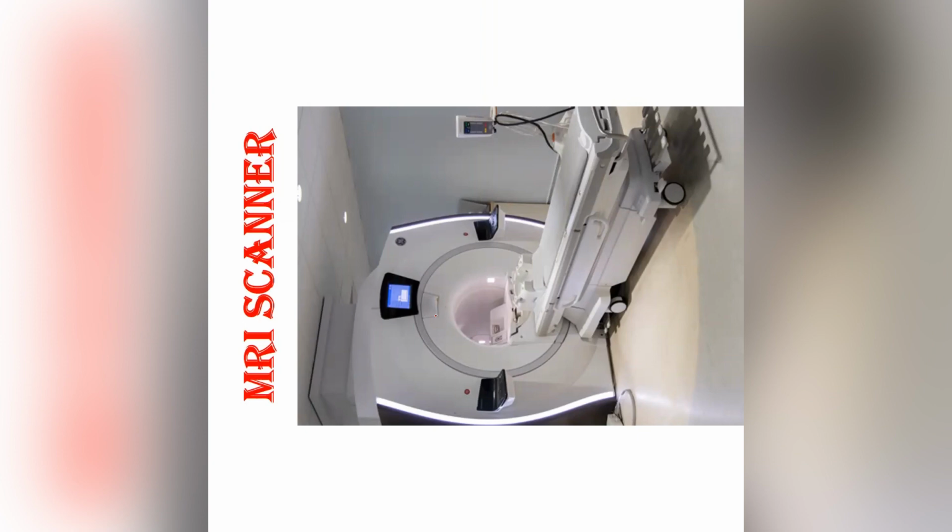This is the couch on which the patient or the person will be lying down. This is the part where the couch will slide and the person goes into the MRI machine. Then this small part is the one that collects all the energy from the protons in the person's body. You'll understand this in the next few seconds when I talk about what energy I am talking about. So this is the usual setup.